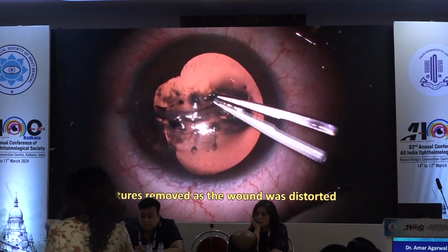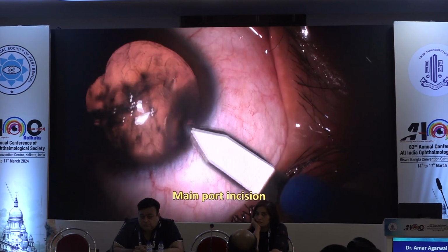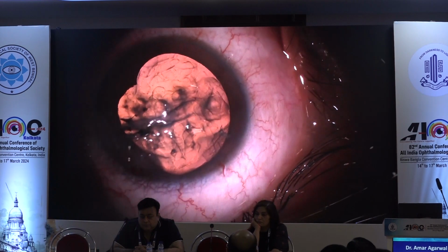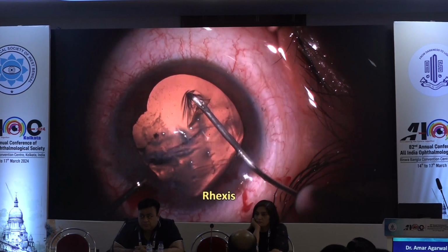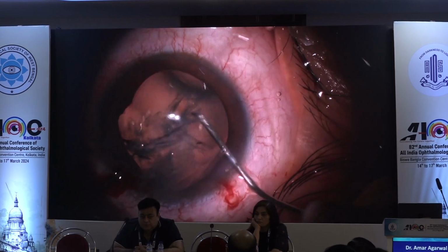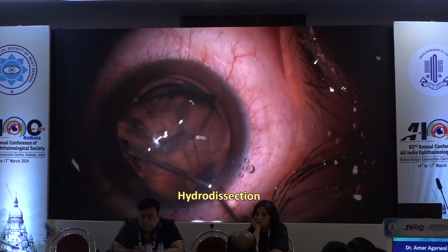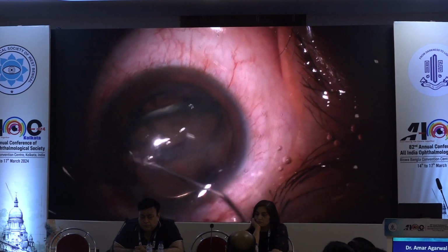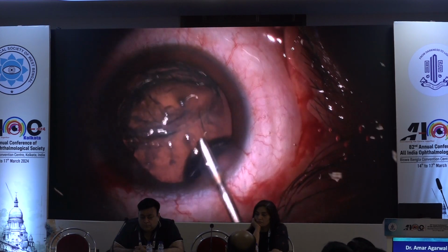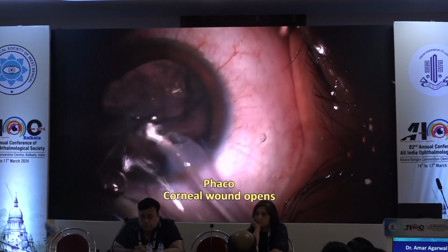So I thought, let me remove it. There is a traumatic cataract also present there. So now what I'm doing is, I'm doing a phaco, and now you see the fastest phaco in the world. Just watch. It happened so fast, I had to see it in slow motion later on while I was editing my video. Look at that. I've done my hydrodissection. Now I'm going for my phaco, and you'll see that in a second, and gone.